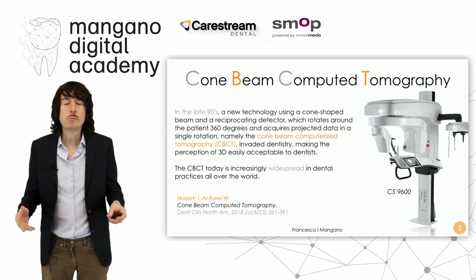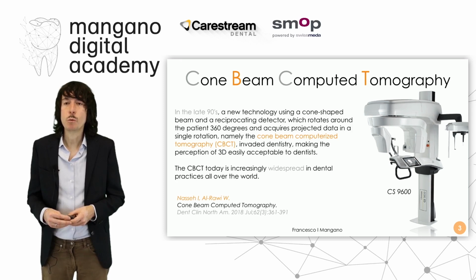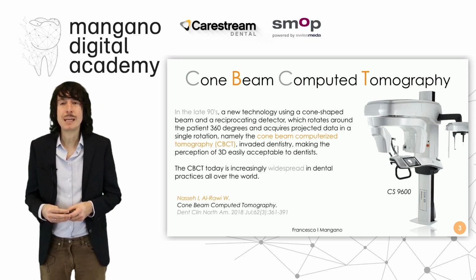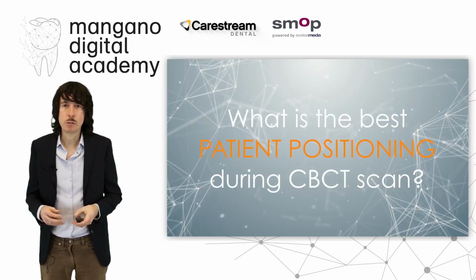As I told in the previous lecture, cone beam computed tomography is a game changer in the modern dental clinic. It's one of the doors to digital dentistry. It appeared in the late 90s and it revolutionized completely the way we acquire data from our patients, opening the door to the 3D world, to the third dimension. And it's not surprising that these machines are now spreading all around the world, and they are almost in all dental offices because they can change dramatically the way in which we make our diagnosis, and also the way in which we plan the treatment of our patients.